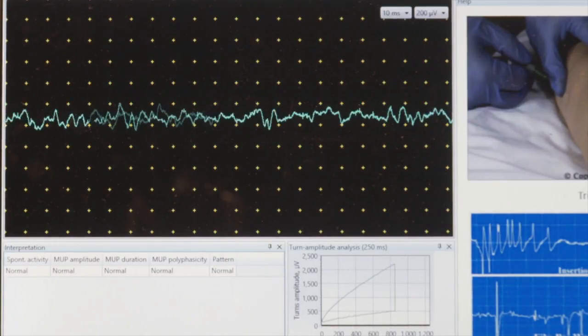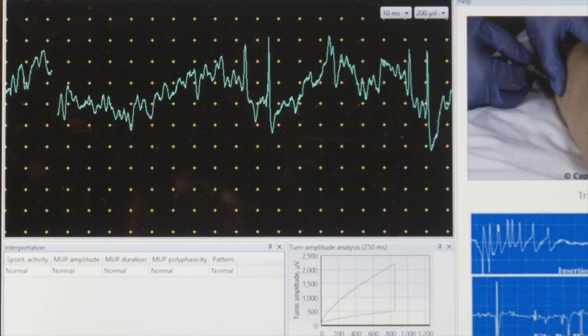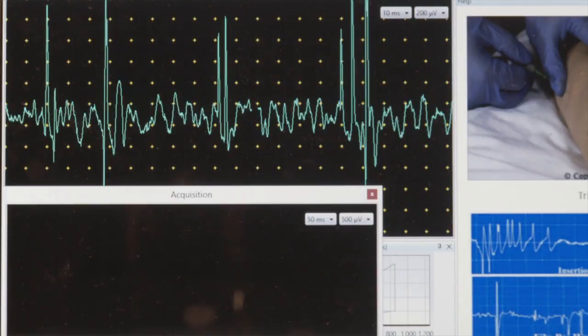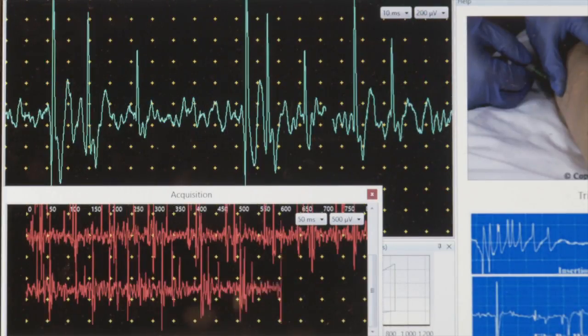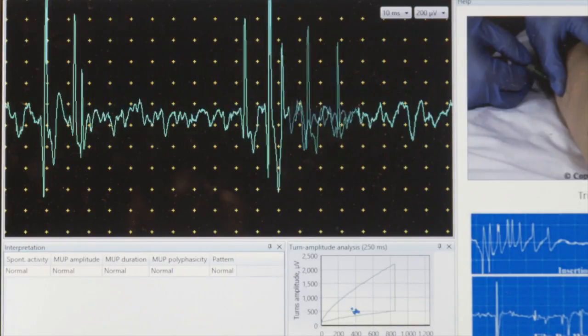The first thing I do is the mild contraction. I'm going to ask you to extend your forearm like so - push against my hand. This is mild contraction and you see where the dots fell inside the cloud.